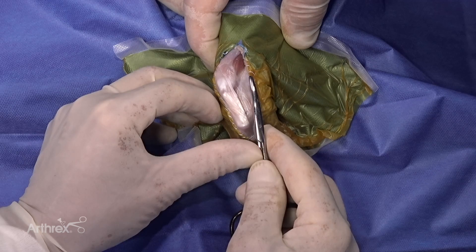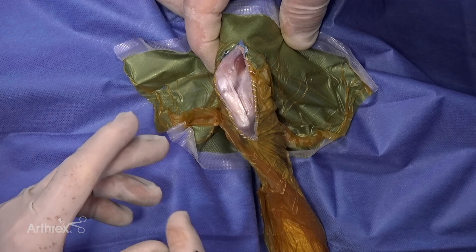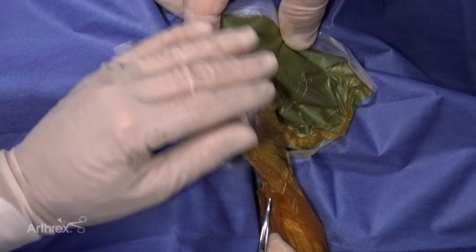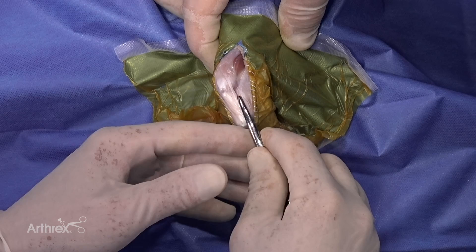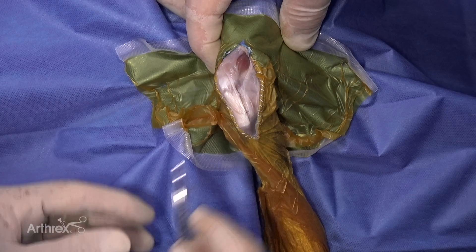You can see the small suture where we've sutured the ioband drape to the subcutaneous tissue. You need to do this if the ioband does not stick well to the skin, because you do not want the 1.3 millimeter suture tape touching the skin. I've made a peripatellar incision through the fascia lata, and you can see the vastus lateralis here.